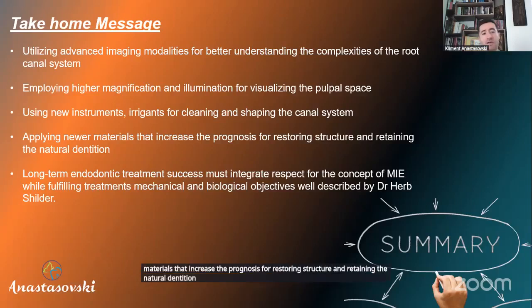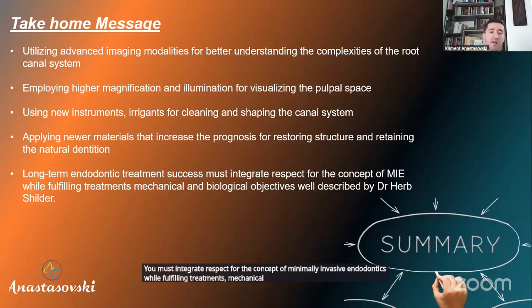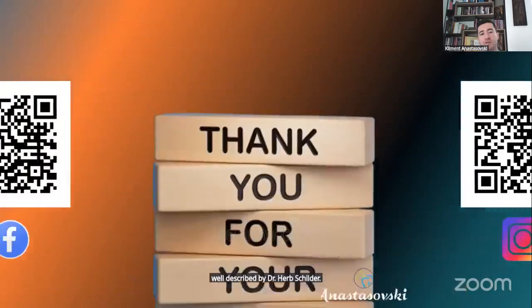And for a long-term endodontic treatment success, you must integrate respect for the concept of minimally invasive endodontics while fulfilling the treatment's mechanical and biological objectives, well described by Dr. Schilder. So that is all for today.